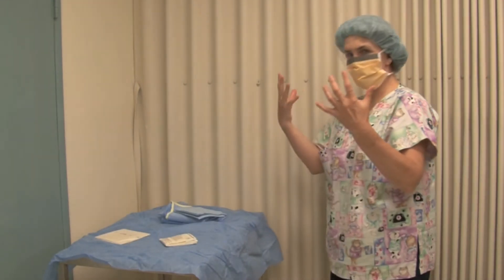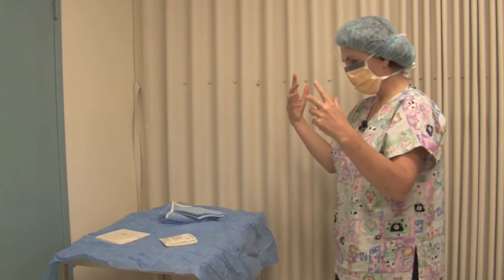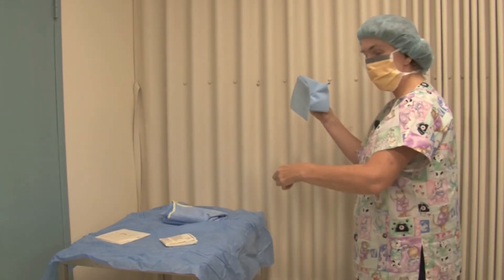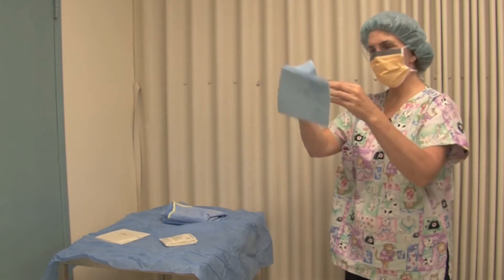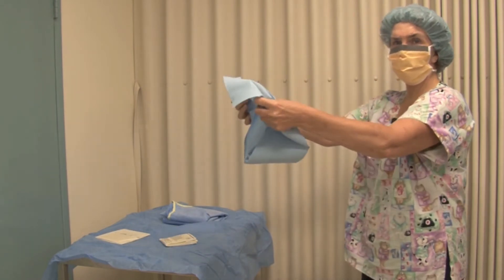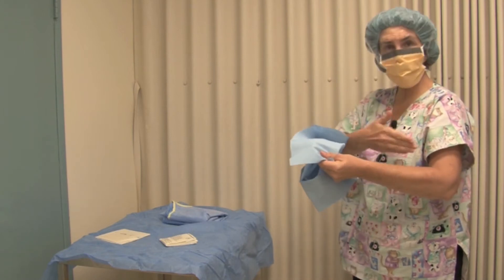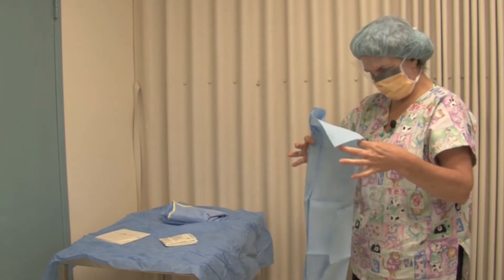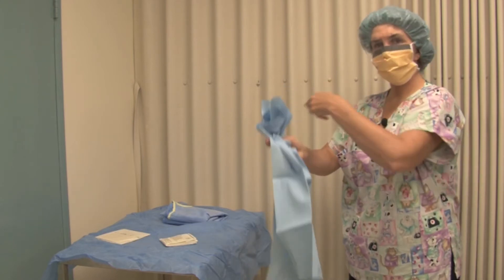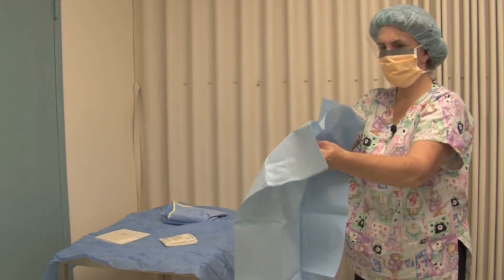I've come back from the sink and my hands are quite wet. I don't want to drip water onto my sterile field, so I've just got to make sure that most of the drips have dripped off. I reach across — and you can see there's a reasonable distance between myself and the trolley — and I've picked up only the cloth. Now this is quite a big cloth, and you'll see I've got my hands quite extended. If you put your hands in too far and try to do this, you contaminate your arms, and when you drop the towel it will hit the front of your gown, and you'll have to ask your Scout nurse for a new towel. Make sure you've got it at a reasonable distance away from your body.